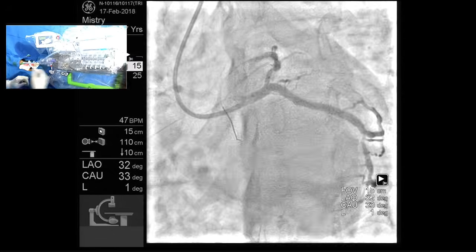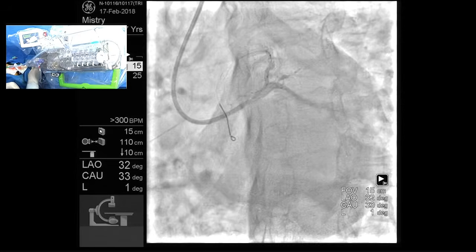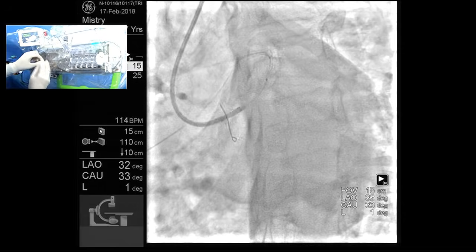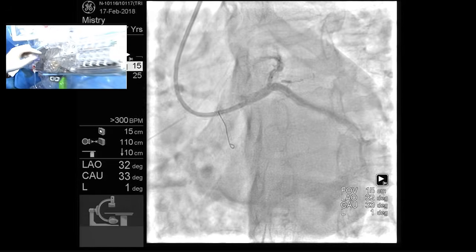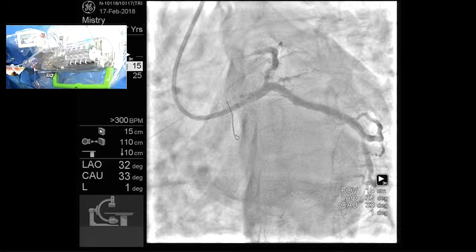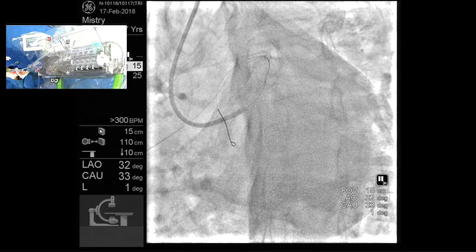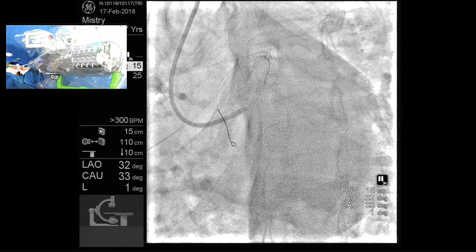And the circ you saw, we have stented in acute MI. It was all thrombus there. In fact, that circ flow in the last procedure's angiography versus now, what you were talking about, the inflammation in the circumflex during that acute MI was outrageous. And now it looks so much better.